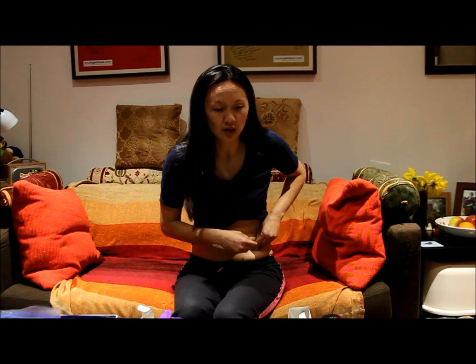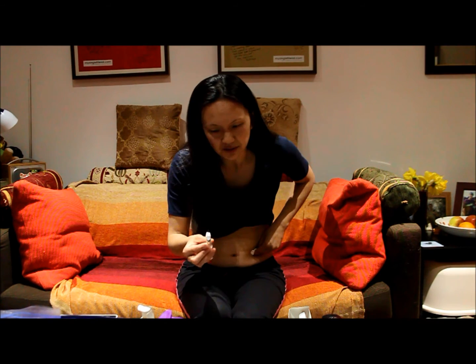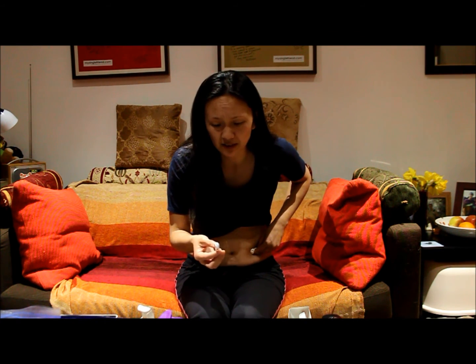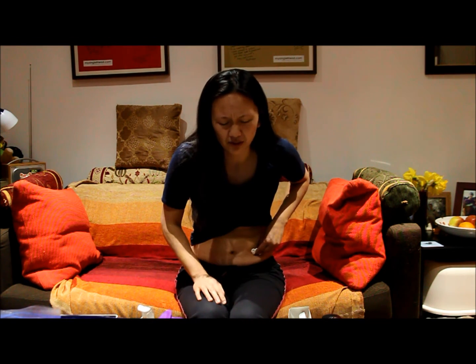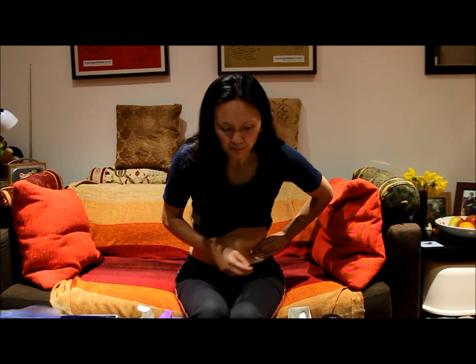Hold the cotton pad down gently — one, to catch any blood, and two, because the tugging out of the needle can sometimes cause a little bit of pain in the skin area. You may have noticed the needle on this one is a little bigger than the last one, but at the end of the day it's still a pin prick. The key trick is to hold the plunger down for 10 seconds before pulling out — if you pull out before then, it's not the end of the world, but it's just to make sure all the drug goes in. I've got a tiny bit of seepage so I'm going to hold it a little bit longer.